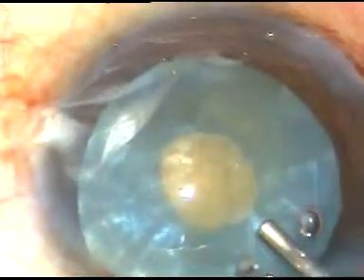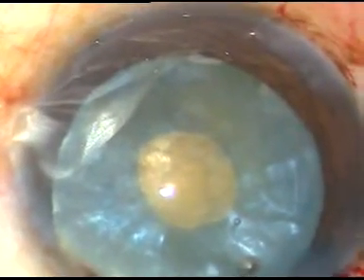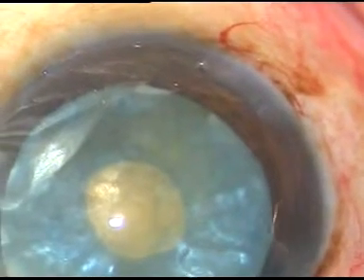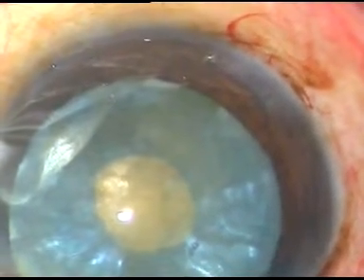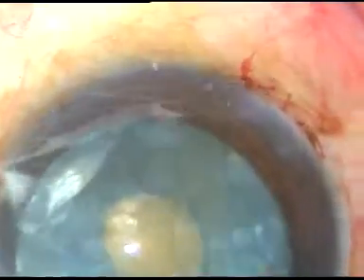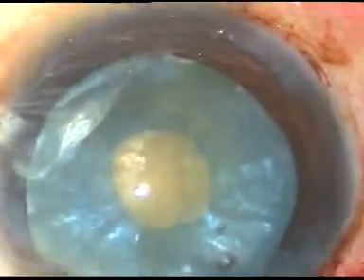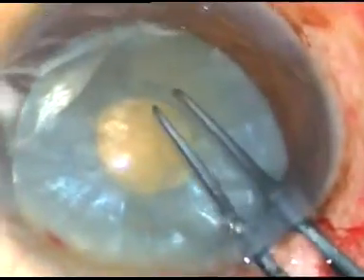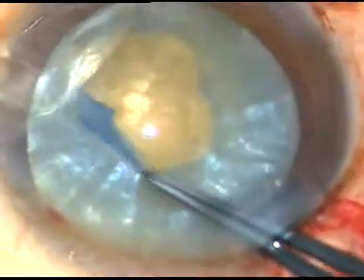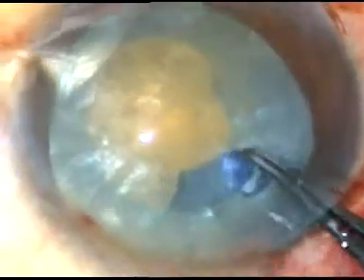I have injected HPMC again — no other viscoelastic substance, always HPMC. Now I use a Vannas scissor and make a nick here. Then I take the outer tag again, hold this capsular tag, go all around and enlarge this mini rhexis into an optimum-sized one.